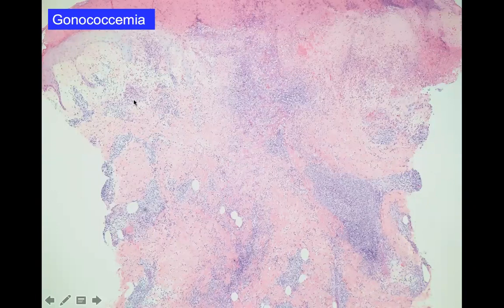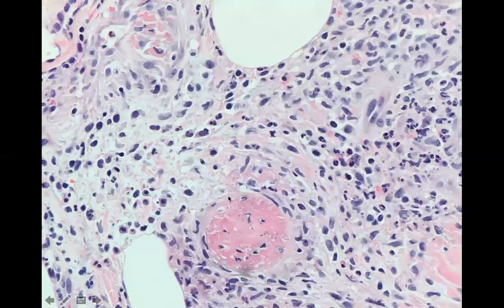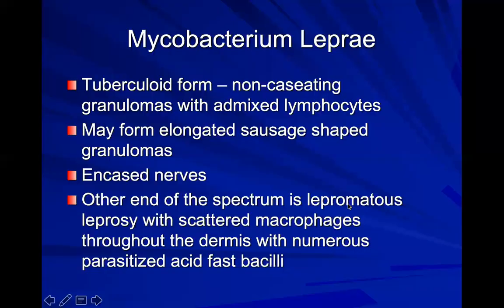So why do you have poor perfusion? You're going to look and you have this superficial and deep inflammatory cell infiltrate, and you start to see these little clumps of fibrin suggesting that your vessels might be plugged. And if you look around, you see lymphs, you see histiocytes, you see neutrophils. You don't see a bunch of eosinophils, right? This is not an allergic process. And then you see fibrin in your vessels because they're damaged, and this is a little bit of a thrombotic process as well. And then you might, if you're lucky, see cocci inside of your vessel.